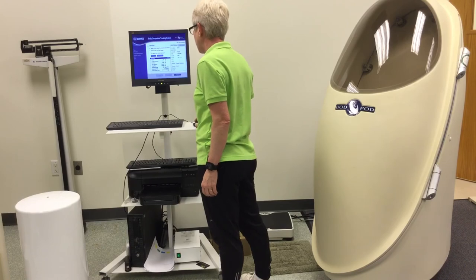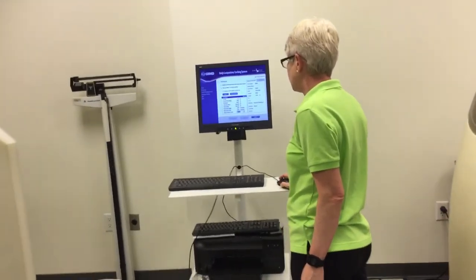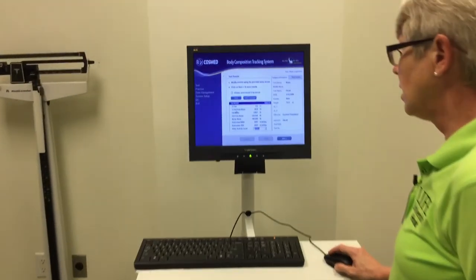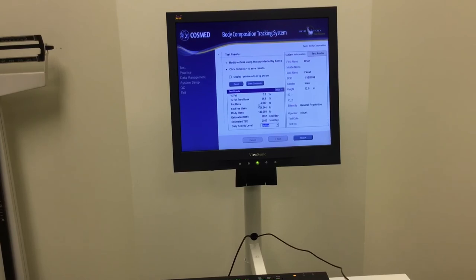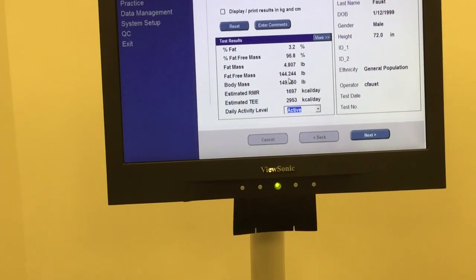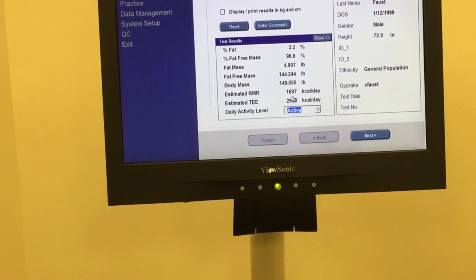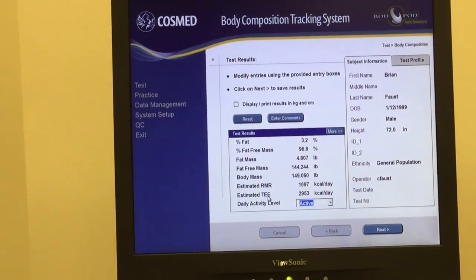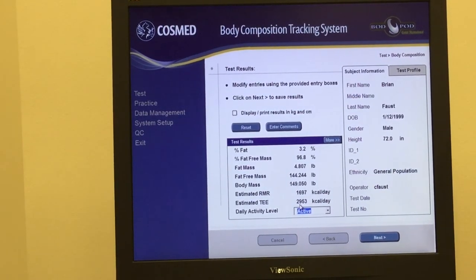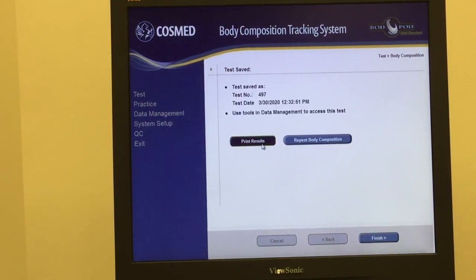We click next and it's going to ask me to modify. We come down here to his daily activity level — he's active. We can see he's 3.2% body fat, 96.8% fat free mass. Total fat mass is 4.8 pounds, fat free mass is 144 pounds, and his body mass is 149 pounds. To maintain, his resting metabolic rate is 1,697 kcals per day. With activity level, his total energy needs are approximately 2,900 kcals per day. We click next and you would be able to print your results.